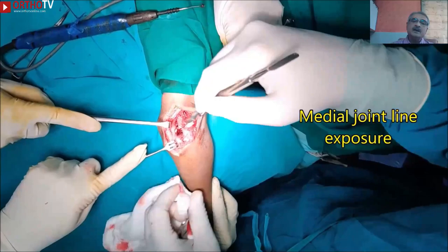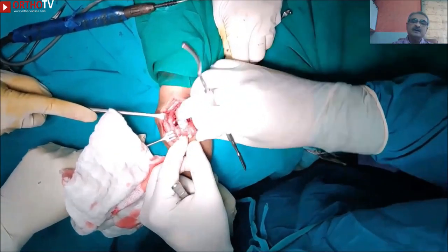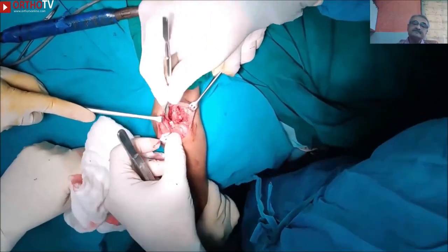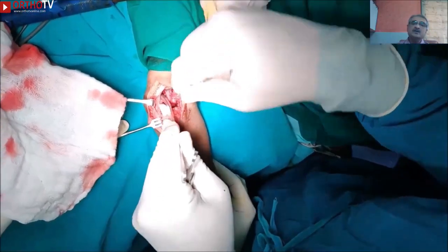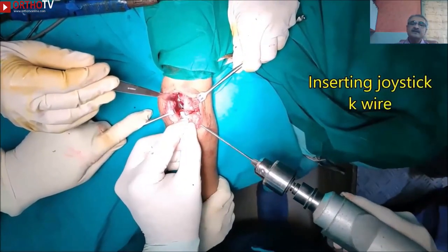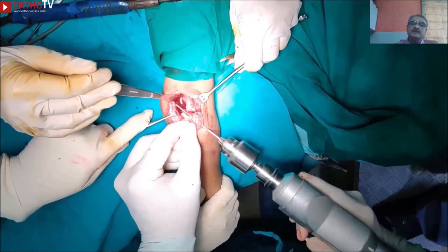To confirm articular alignment, further dissection to expose the medial joint line is carried out. Once the fragment is rotated, to manipulate it in a better way, we use a joystick. Here I am trying to coax the fragment without the joystick, which is quite difficult when the patient presents late. Inserting the joystick helps in aligning the fragment while keeping a safe distance, allowing easy manipulation.